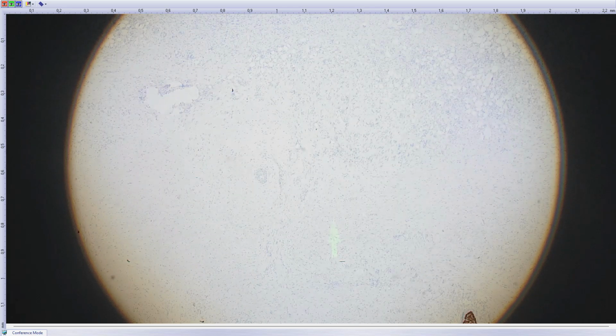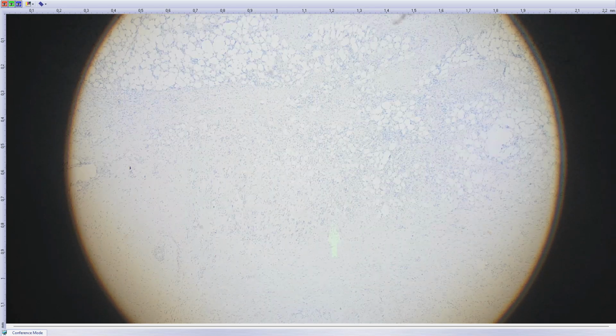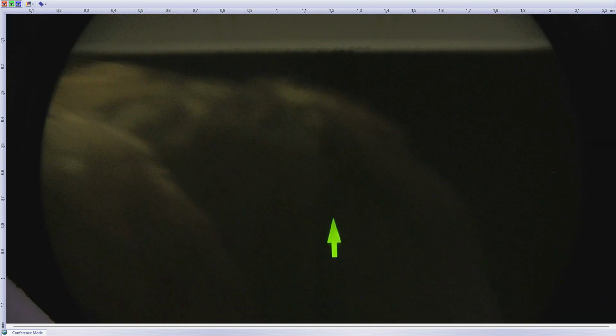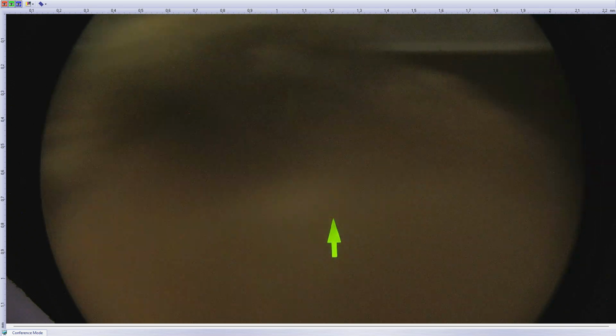So I think when you put all the findings together, actinically damaged skin, old person, tumor on the face, suspicion for epithelial dysplasia, spindle cell atypical proliferation with this immunoprofile, I think this is sufficient to call this sarcomatoid variant of squamous cell carcinoma on the face. And my last case was a 37-year-old male, tumor on the peritoneum.